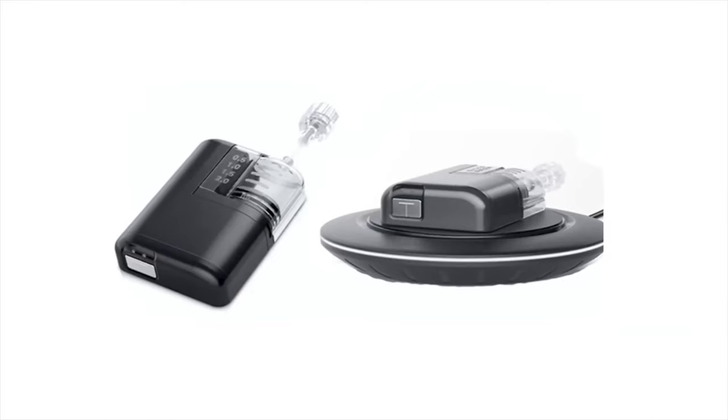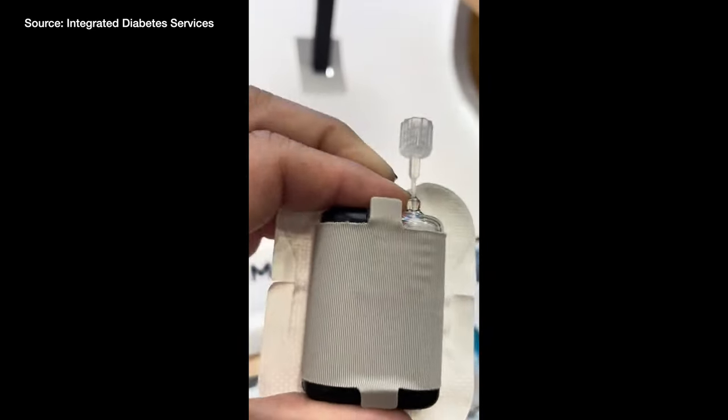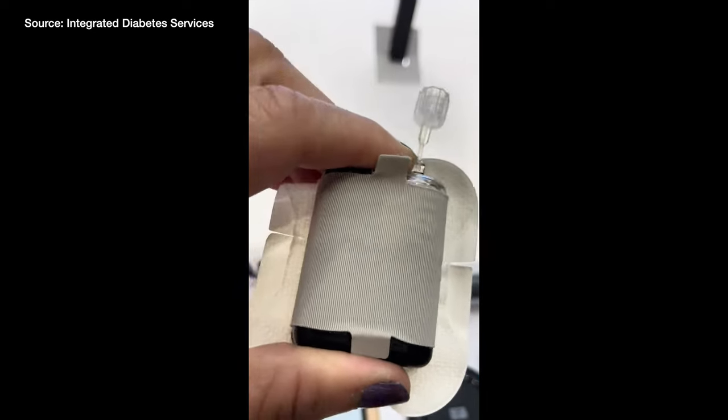But today what I want to do is tear this down, show you how it looks, how it works, what the buttons and the LED lights do, and kind of give you a little tease with this demo unit. This is not a working unit, but I've got a lot to say based off of this.